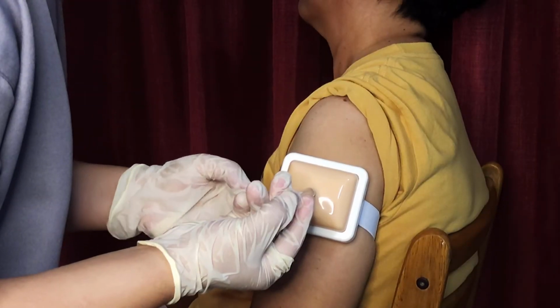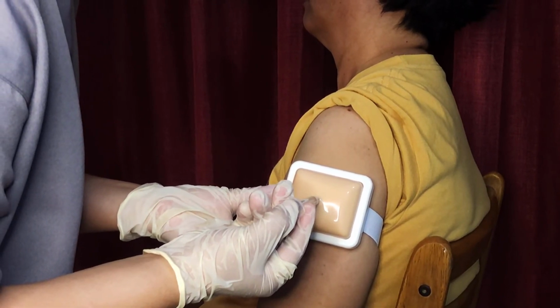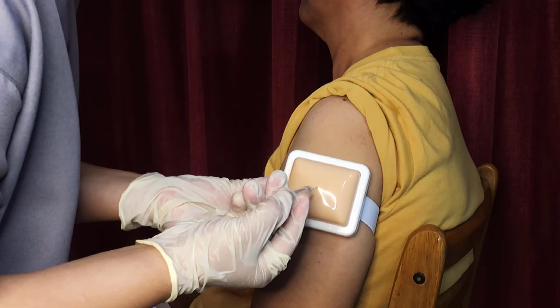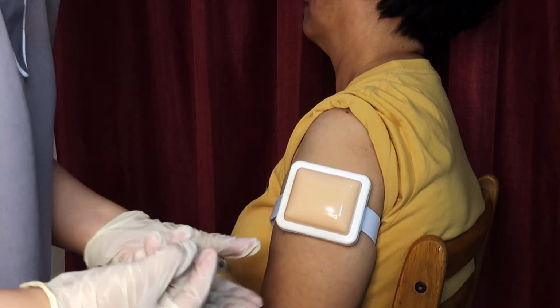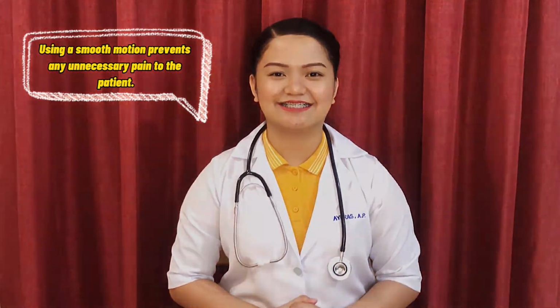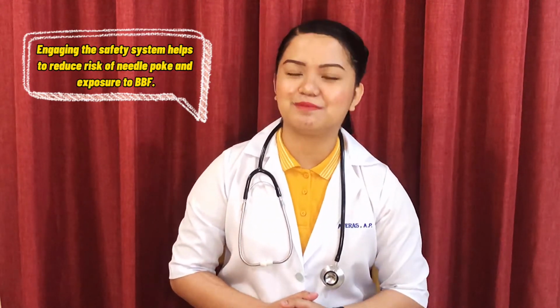Once the medication is completely injected, remove the needle using a smooth, steady motion. And yes, engage the needle safety system immediately. Using a smooth motion prevents any unnecessary pain to the patient. Engaging the safety system helps to reduce risk of needle poke and exposure to bloodborne pathogens.